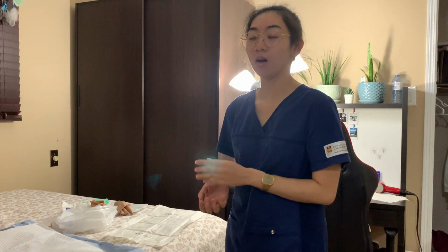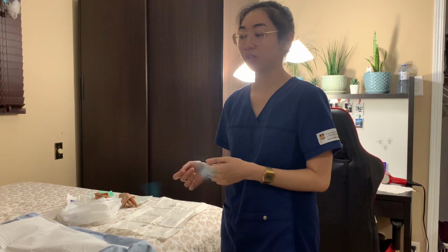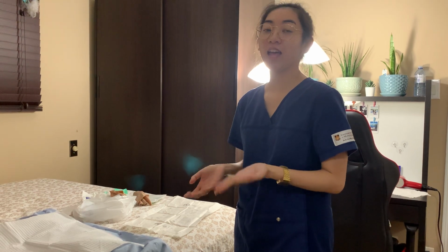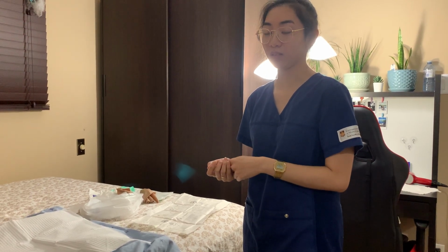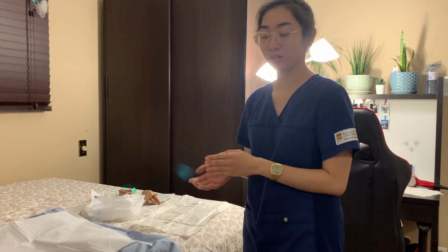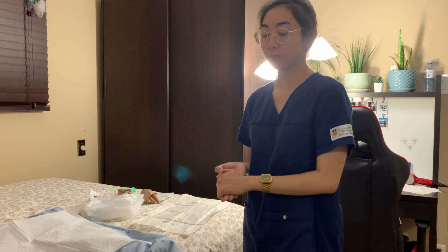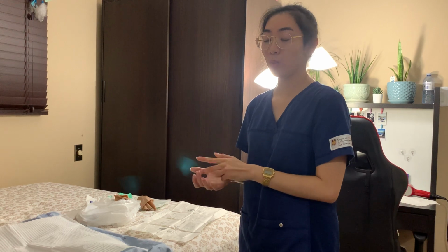And as I leave the room, I'm also going to document that I did a chest tube dressing change, that I removed the old dressing, which is a Jelonet, two drain sponges, 4x4, and a Mefix, and that there is no drainage. I'm also going to write down that I assessed the site. The site has no redness. The periwound skin looks healthy. There is no drainage, which means there is no infection. I'm also going to write down that I cleaned the wound with normal saline, and that I put in new dressing, which is Jelonet, two drain sponges, one 4x4, and Mefix, and that the patient tolerated it well.